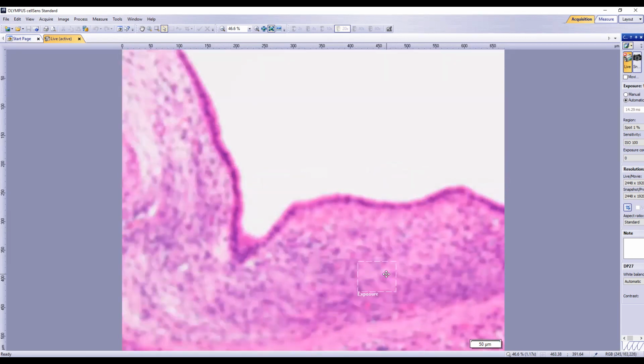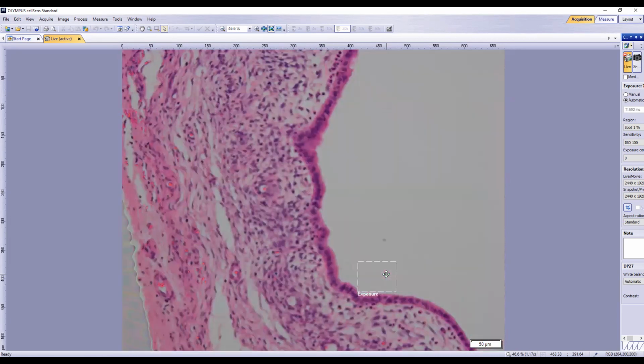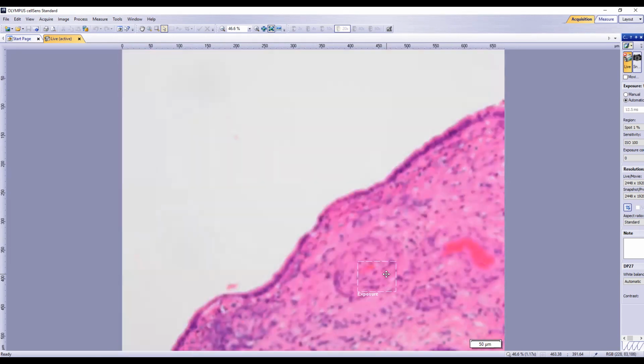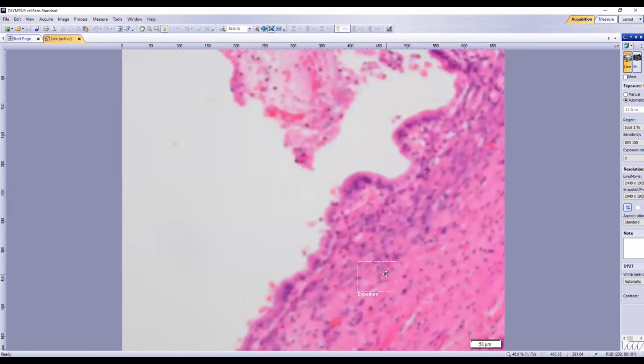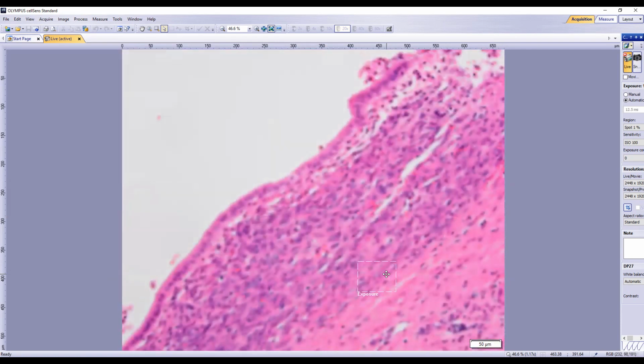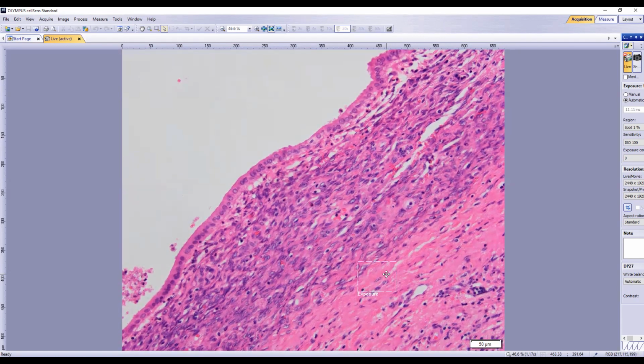Is it endometriosis? The stroma looks different. So if the stroma looks different, what is it? Ovarian type, I think. Yeah, it's an ovarian type stroma. And the epithelium is not quite mucinous. Correct.